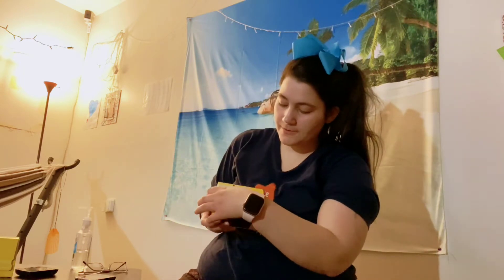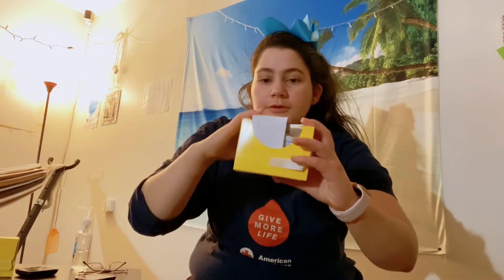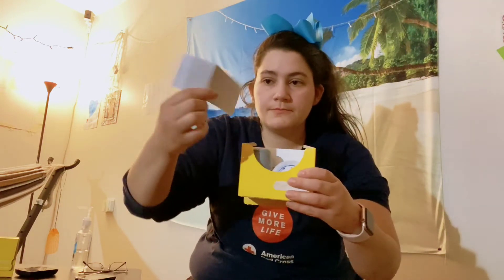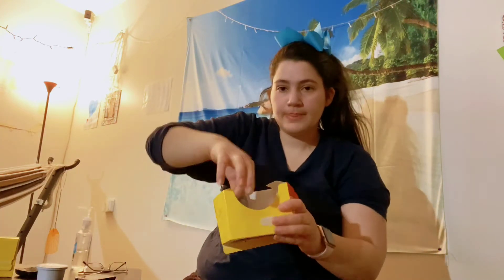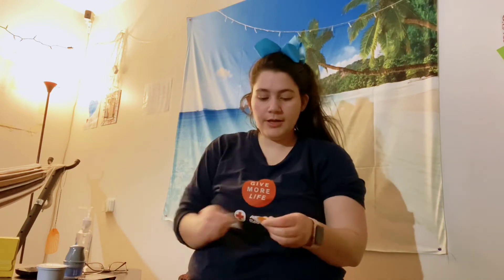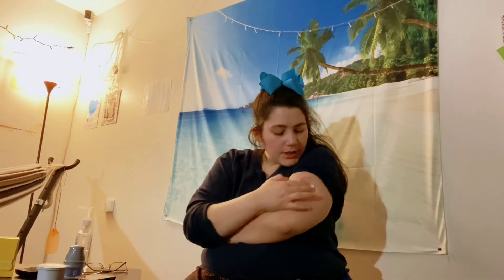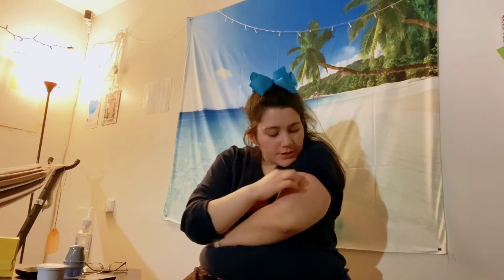We're going to go ahead and peel that off, lift this open — read it if you want to — and pull out your two parts. They even include alcohol wipes, so you're going to take your alcohol wipe.